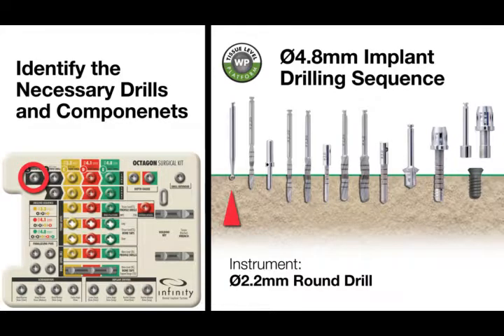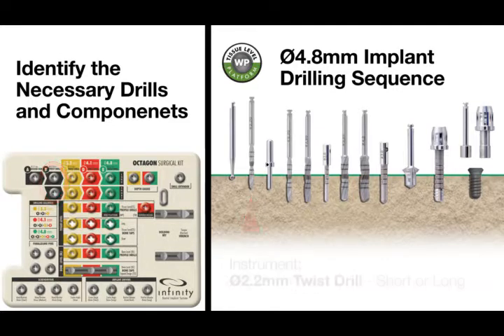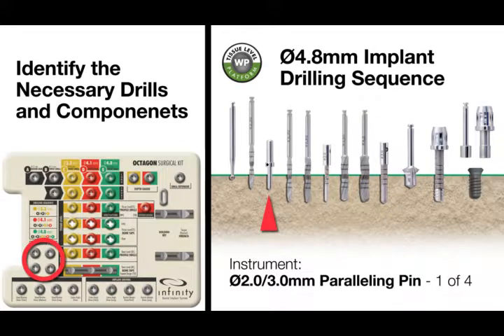First, choose the 2.2 mm diameter round drill from location A, marked in black on the surgical tray. Second, choose the 2.2 mm diameter twist drill from location B, marked in black on the surgical tray. Choose the 2 mm 3 mm paralleling pin. 4 paralleling pins have been included in your Infinity OCTAGON surgical kit.